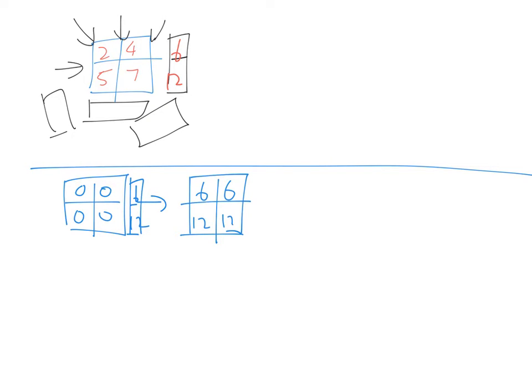Then what happens is the tube and the detector will rotate. So now it scans this side. When it scans this side, it sends in the X-ray here. So this detector will detect that these two have absorbed a total of 9. Correct or not? So it only manages to calculate the total absorbed, 9. But for this side, the X-ray only passes through 1 voxel, you see. So the value of 1 voxel is the total absorbed here as well. So that one is just 4.